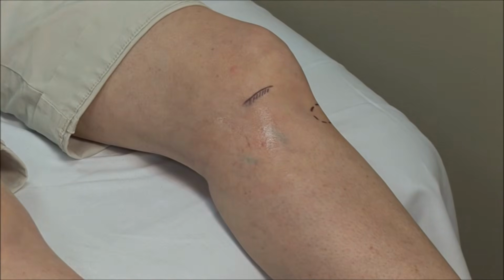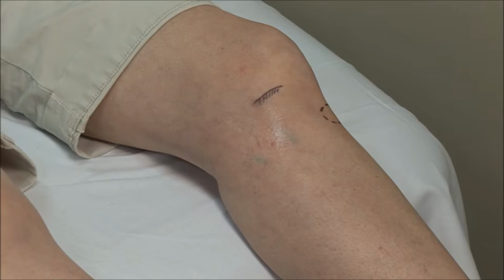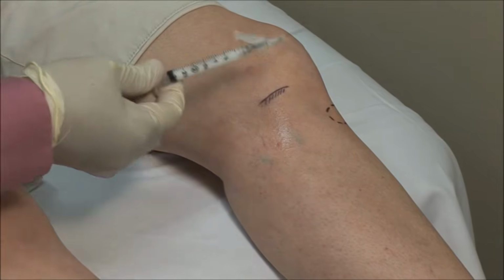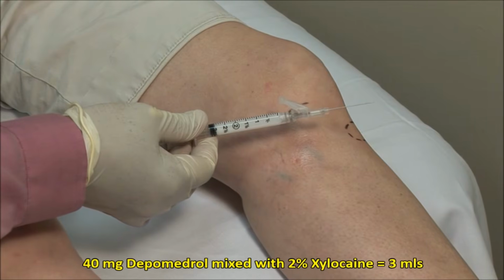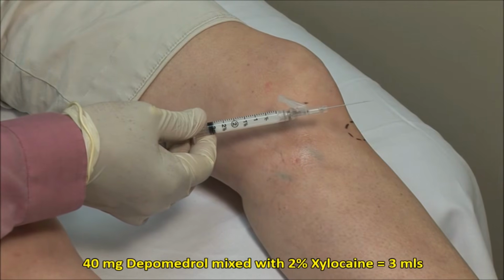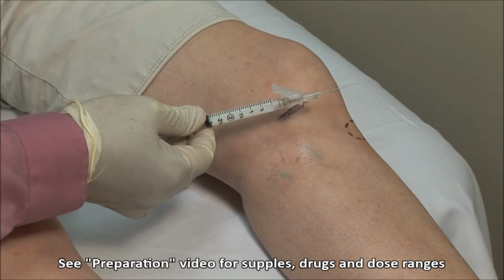Local anesthetic can be applied to the skin and subcutaneous tissue using a 25 gauge needle, but the experienced clinician may forego this. Here I have a mixture of 40 mg of Depo-Medrol mixed with 2% xylocaine without epinephrine to a volume of 3 ml, and I am using a 22 gauge 1.5 inch needle.